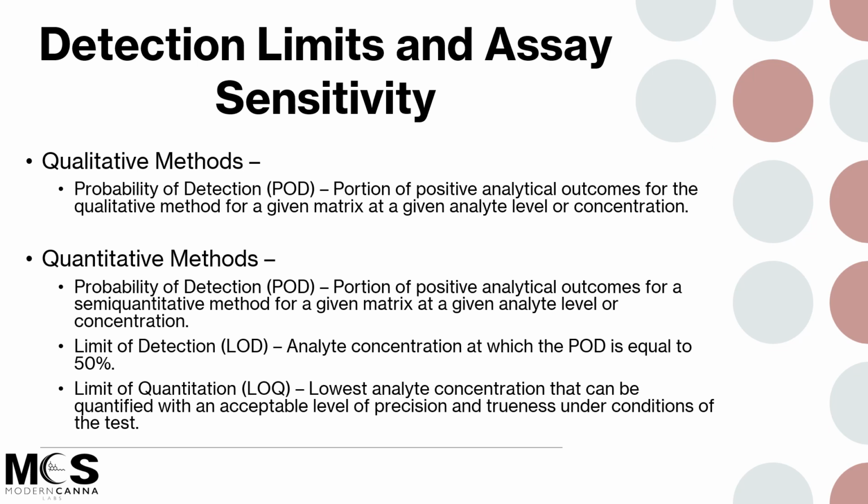So when we think about analytes like Salmonella or Shiga E. coli, where they are deemed presence-absence analytes that have a concentration limit of 1 CFU per gram, can the method actually see that low? Can the method truly see down to 1 CFU per gram? And how do you determine that it was able to do that? And that's part of this method development process is, can we certify that our method is sensitive enough to be able to detect the microbe at 1 CFU per gram, which is an extremely small amount of microbes.